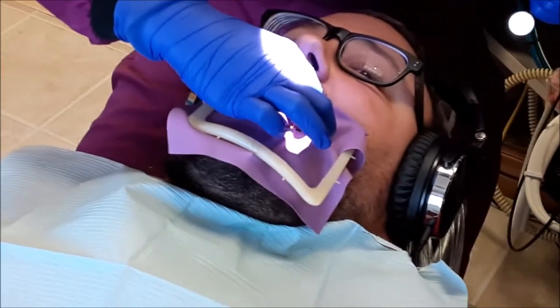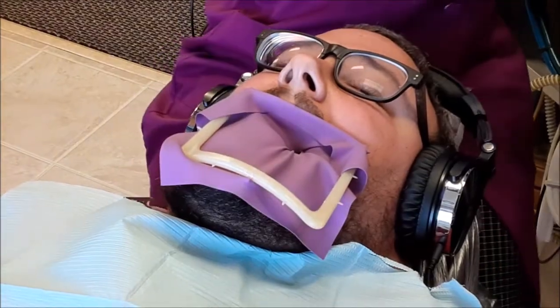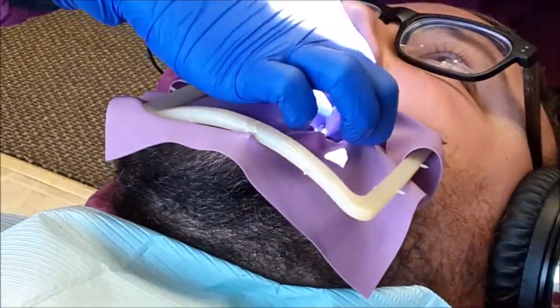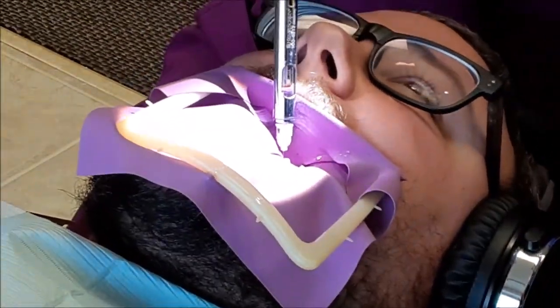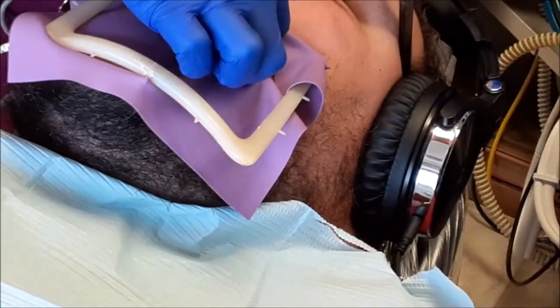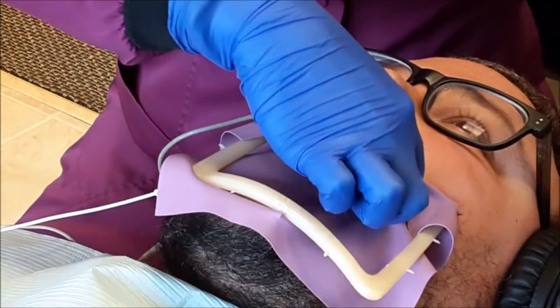So do you actually numb like right down into the root? Yeah. That's kind of good, I guess. Don't want no unexpected pain shooting out of there. How long the root is. Oh. Man, it's so cool. All the technology. So no guesswork.